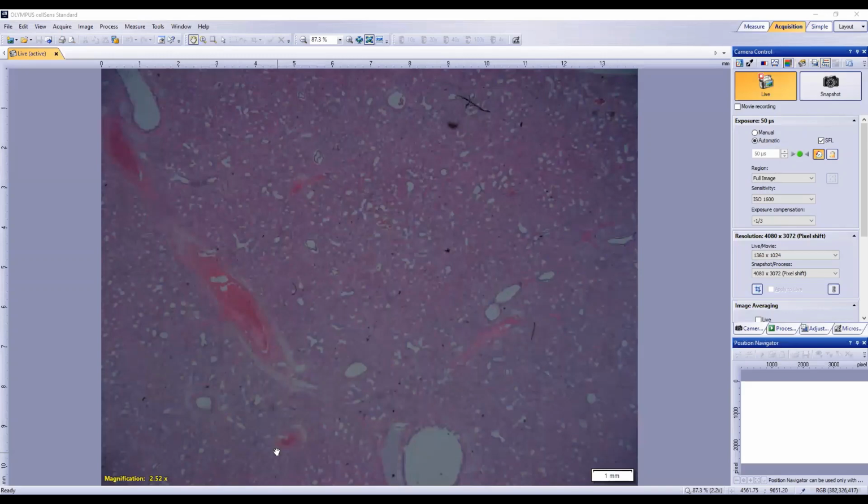But my understanding is that normally you would see just an interstitial pneumonia, wouldn't you? Yes, yep. So you wouldn't expect to see it quite so consolidated like this. It's kind of a pure interstitial process, but from the point of view that the alveolar epithelium, to my mind, is included in the interstitium. So we've got that lining, and then the actual gap between the alveoli itself, with connective tissue and blood vessels.